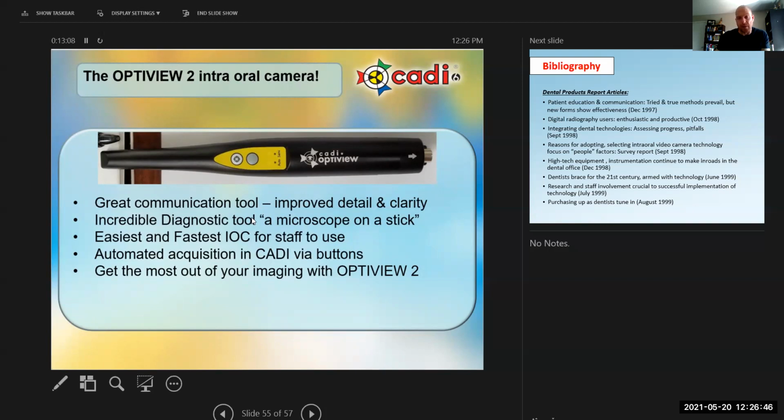There is nothing, I think, more important than being able to introduce patients to their teeth visually by anatomically charting the teeth visually, being able to show patients exactly what you're talking about. And it just takes the onus off of the dentist or hygienist or dental staff to be able to communicate what they're seeing and what the issues are. It's so much easier when you start using pictures.